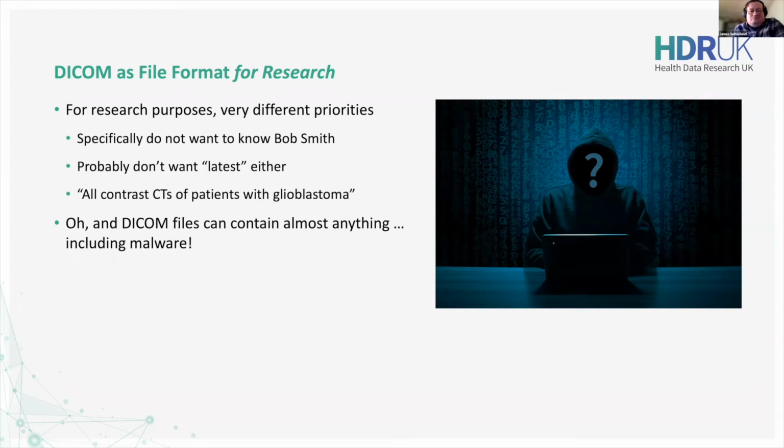Now, it's a mixed blessing. DICOM files are extremely versatile. They can contain almost anything, including, as someone pointed out fairly recently, they can actually include malware, which is perhaps a little too flexible in some respects. We actually have a possible research project coming up on that in the near future. I'll talk about that a bit later on.